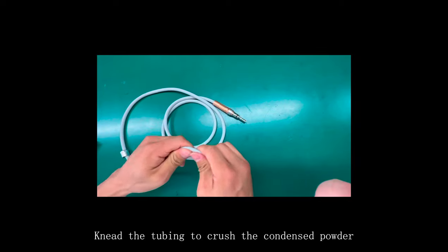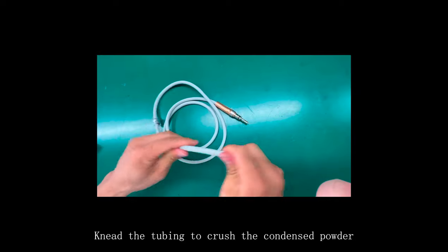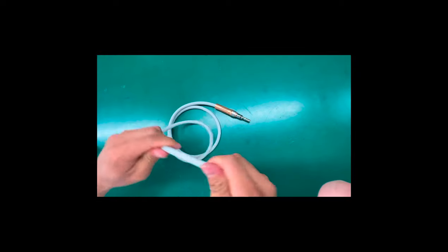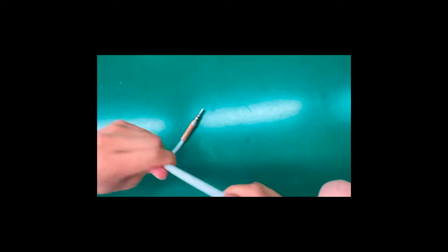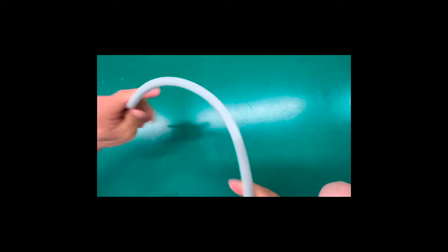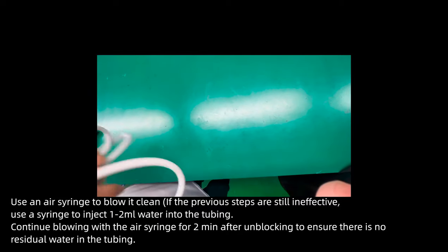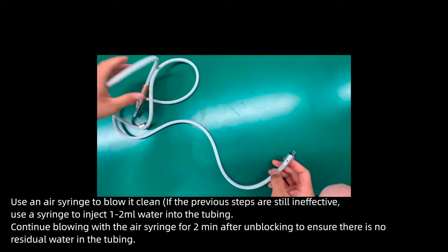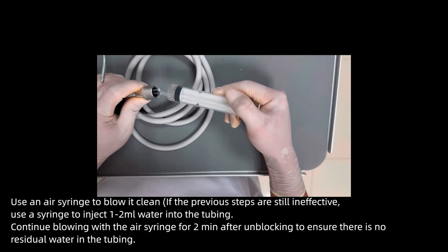Knead the tubing to crush the condensed powder. Use the air syringe to blow it clean. If the previous steps are still ineffective, use the syringe to inject 1 to 2 ml of water into the tubing. Continue blowing with the air syringe for 2 minutes after unblocking to ensure there is no residual water in the tubing.